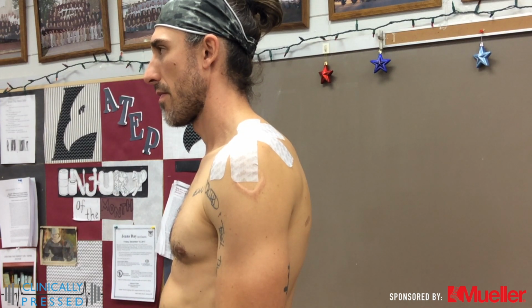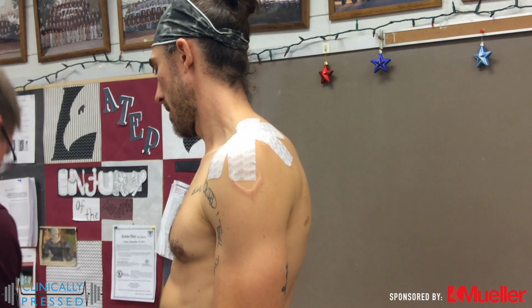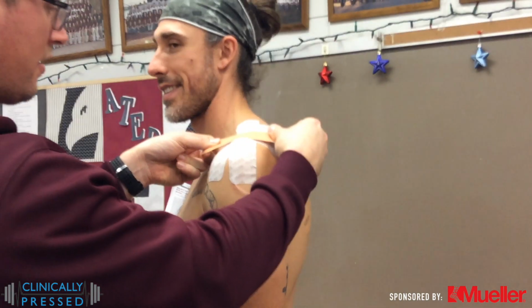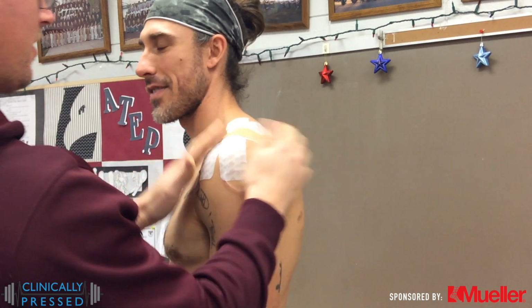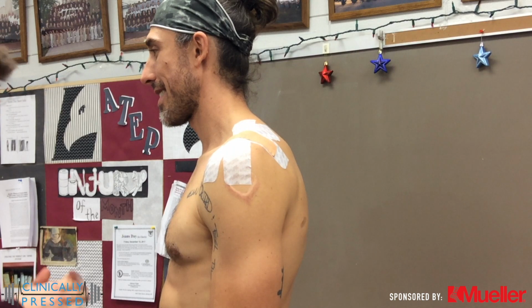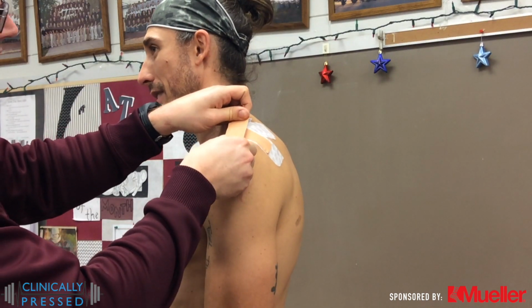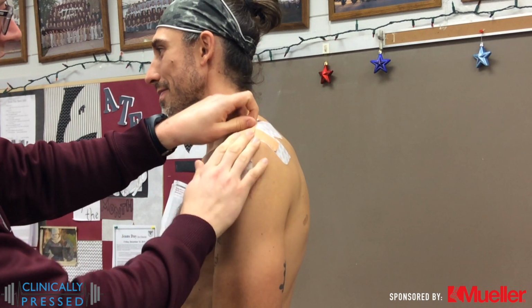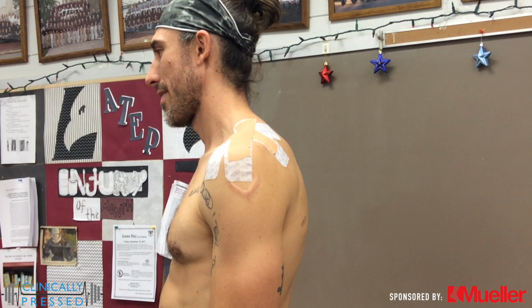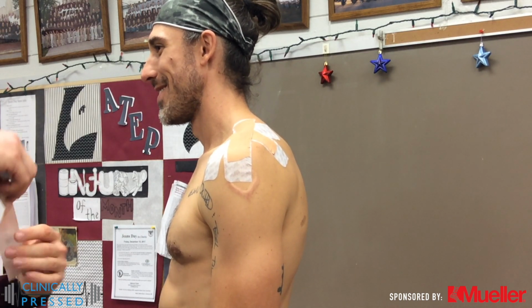So after you get those down, we'll then go to our P-tape strips, which we will cut to length. Easy to do ahead of time. Then we're actually going to place that right over the AC joint, trying to again bring that clavicle down, and have that be our biggest point of tension, and then keeping it equal, applying to the anterior and the posterior, and then for that second strip from the medial to lateral. And then again for this third strip, we want most of that tension coming directly down over it.